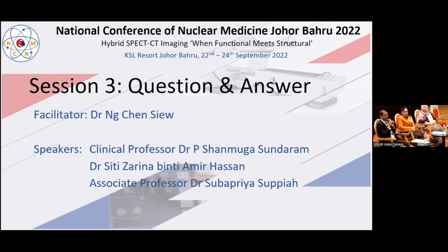That is a pertinent, perfect question, which I can expect from a senior doctor like you, because I know that this is not recommended. That's exactly what I told, that a follow-up study, especially in lymphoma, which is much more frequently done as an interim therapy and a completion therapy, you don't really need to do a contrast study. That's where you need to use quantitative parameters.